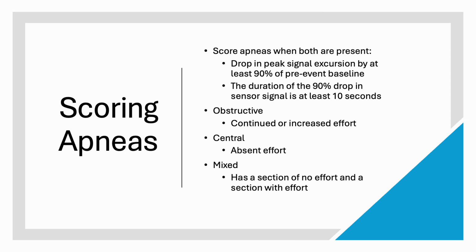You must have no effort and then a change to effort seen for a mixed apnea event. There is no time requirement for the central or obstructive component or which occurs first. The entire event just must last at least 10 seconds.